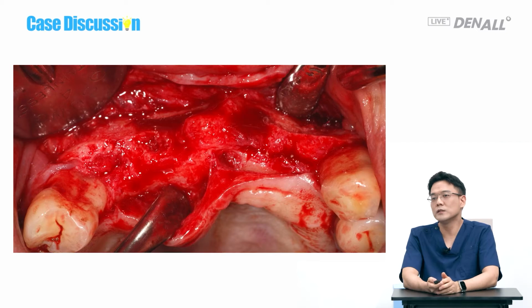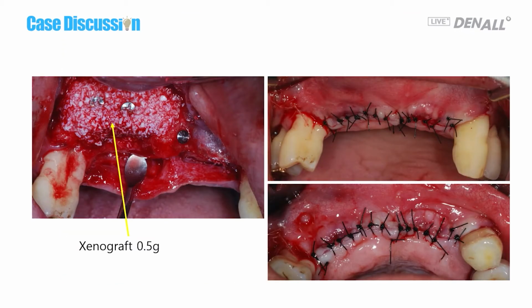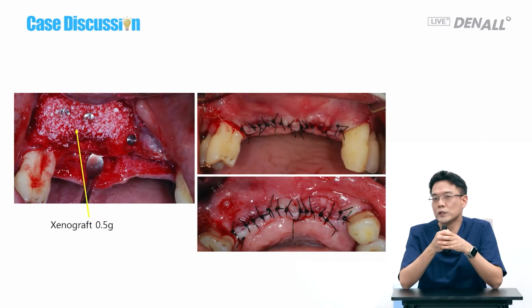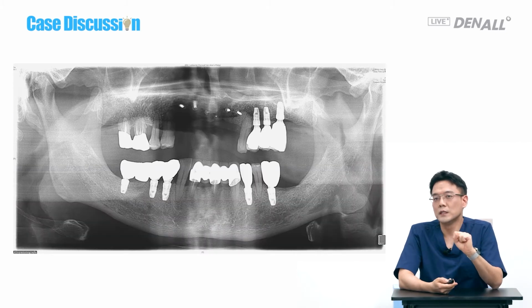So I told her that GBR will be done with the placement, and GBR will be done additionally later. So implants cannot be placed here. As a periodontist, I do GBR a lot instead of a block bone graft. Xenograft and cross-linked collagen membrane are used. To augment horizontally, a tent is needed. With bone graft material only, it can collapse. So tenting screws are used, and the membrane is covering the site, and we waited.